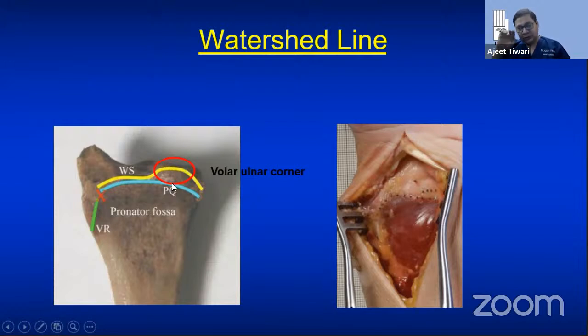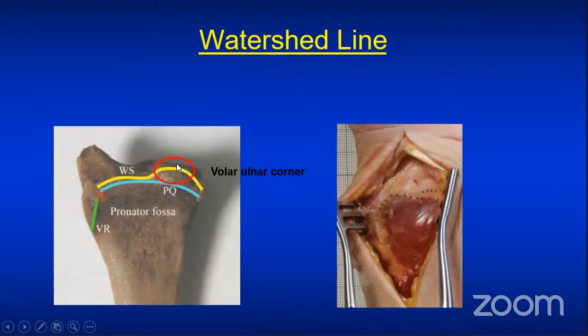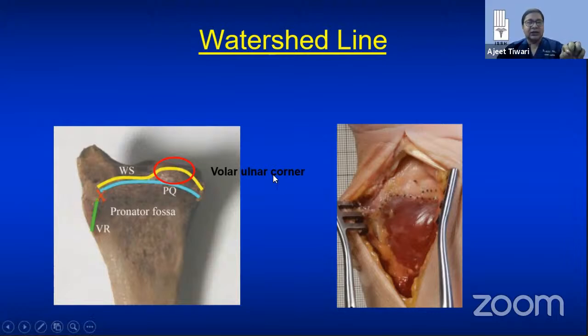What happens is that most orthopedic surgeons use these traditional plates. These traditional plates, T plates, are basically juxta-articular plates. Juxta-articular plates cannot hold the volar lunate fragment. So if there's no hold on the volar lunate fragment, it means a problem will happen. What problem will happen? I'll tell you later.